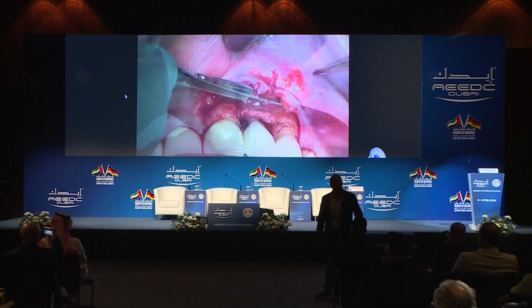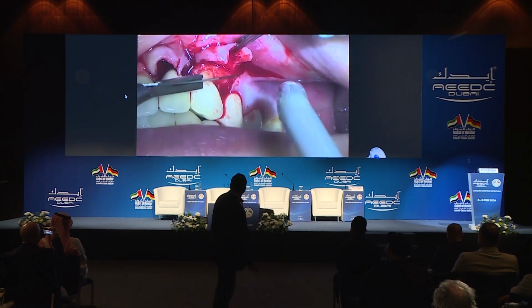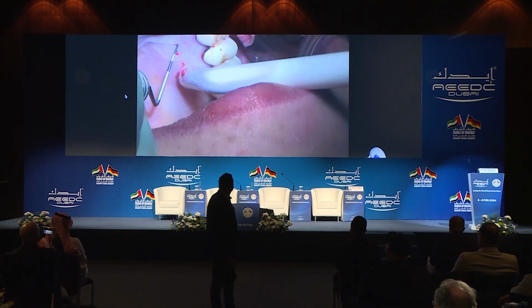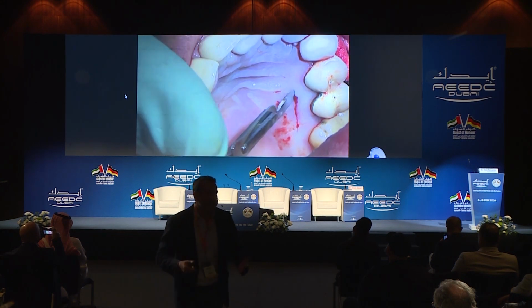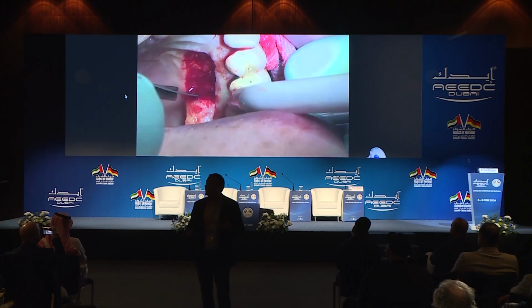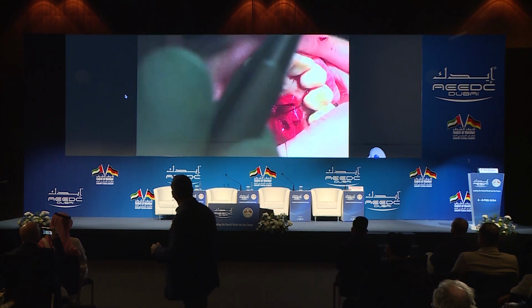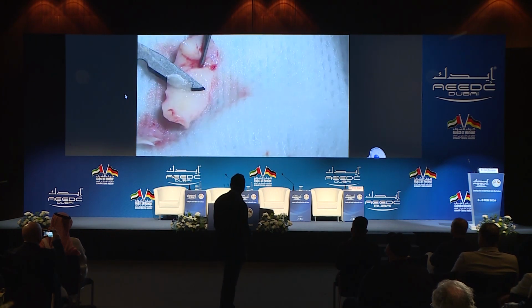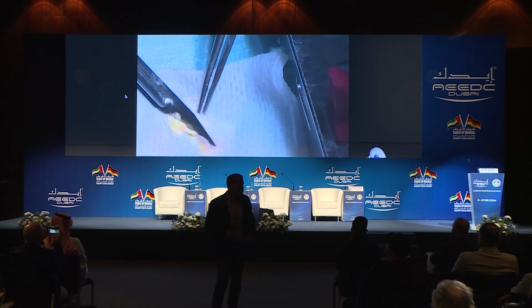So this is what we did. We first started by removing the over contour of the crown, and then we did the double papilla flap on this case. Okay, we did the double papilla, and then I try to go to the tuberosity if I can. If not, if there's a lack of quantity, then we go to the anterior palate. The thickness should always be between 1.5 to 2 millimeters if your goal of treatment is tissue thickness and keratinized mucosa. And we always de-epithelialize this free gingival graft in order to have a good quality collagen hyperplastic tissue to cover the titanium and to hide the titanium implant.